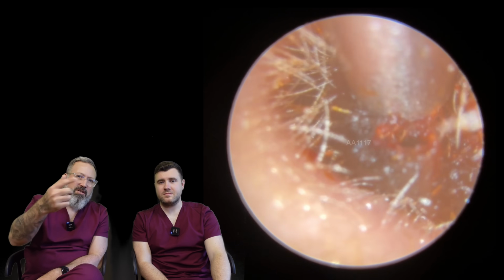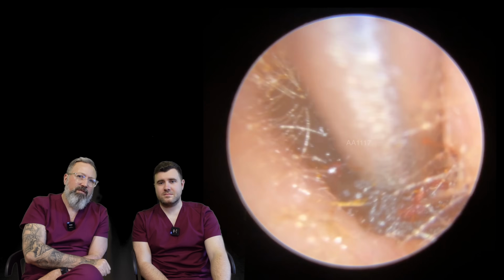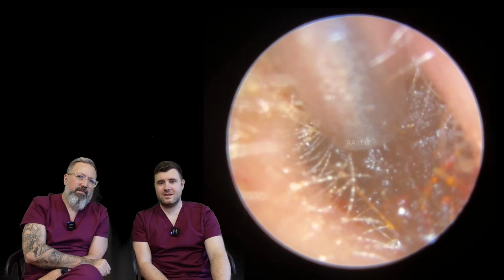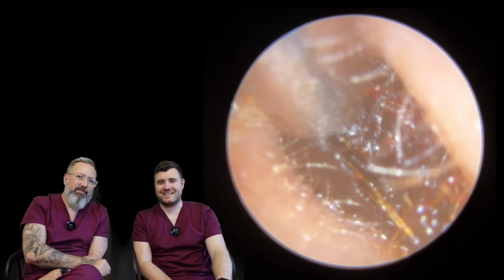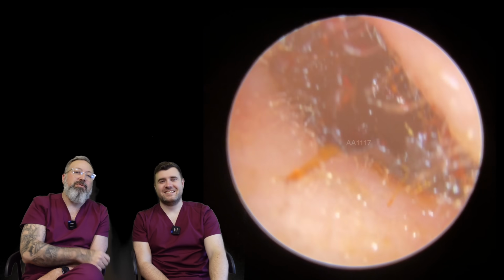So I'm trying to break it down at the entrance of the canal. You'll see I'm constantly rolling, constantly moving this around, flicking back and forth. Come on, nearly there. Go on. Move. And at this point, the patient started to hear better.